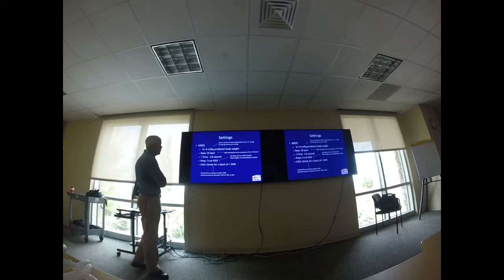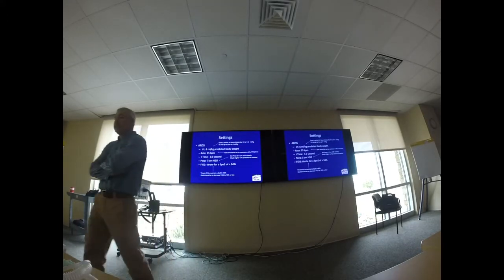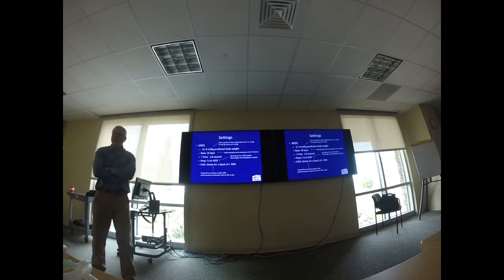So, this comes from ARDSnet. This is ARDSnet. And realize that this is initial settings, and you're gonna want to do some different things to it. So, my tidal volume, 8 mLs per kilo for predicted body weight, right? And you guys all have those cards, correct, that has the predicted body weight? No, so Mark, you need to get one. So in the little AirLink cheat book, there's a thing right there that says predicted body weight. And so I would use that, right?